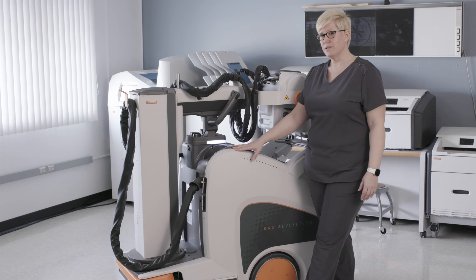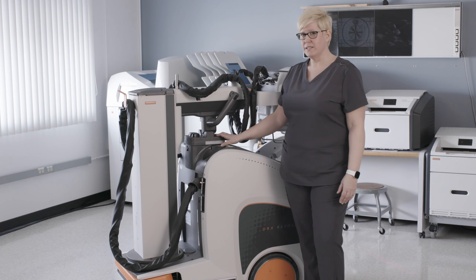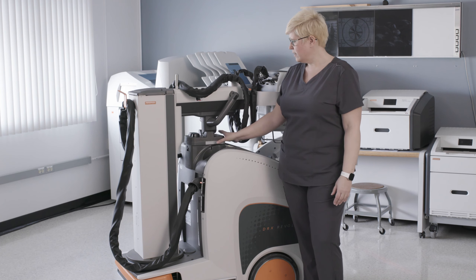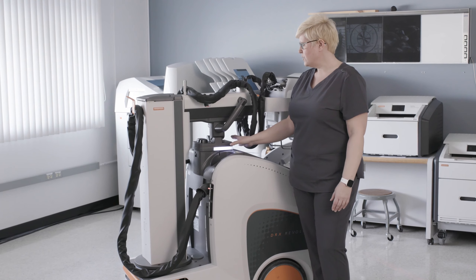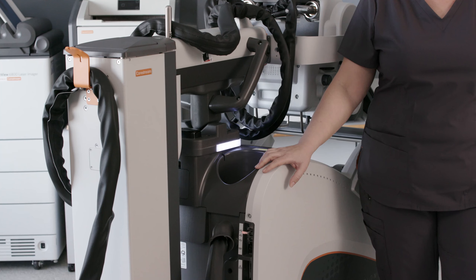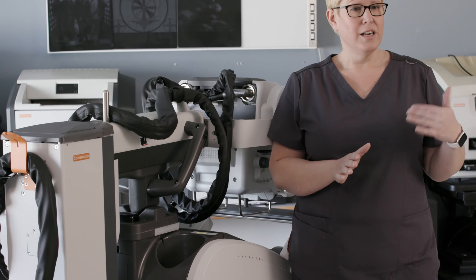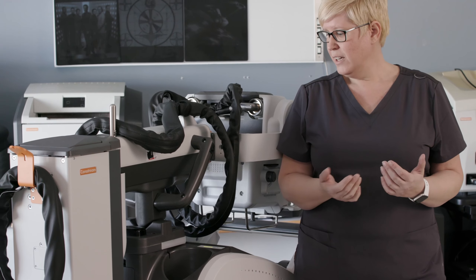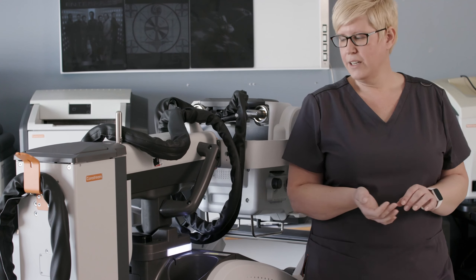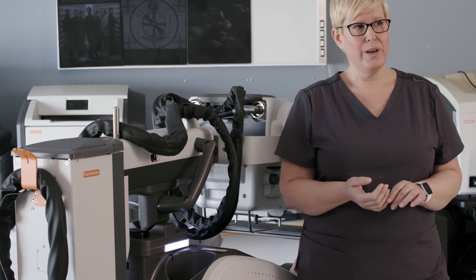In addition to quieting the cart down for the HUSH initiative, we've also added some new features to the Revolution system. The LED cart status indicator here is a visual indicator to the technologist as to what the status of the x-ray system is. We have a few different colors: if the system is ready and waiting for an exposure, it's going to be green; if it's prepping for an exposure, it will be yellow; and during an actual x-ray exposure, it will turn to orange.